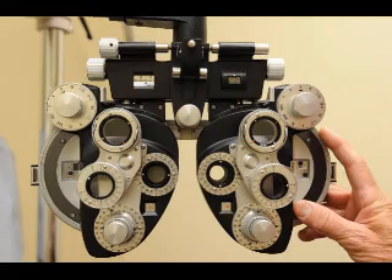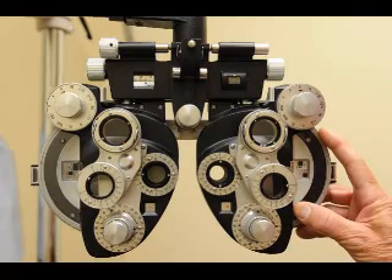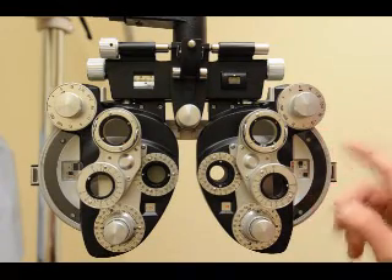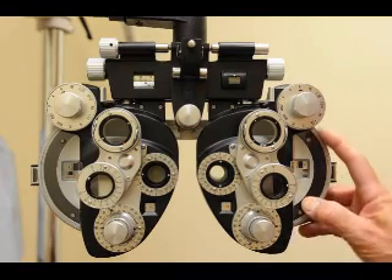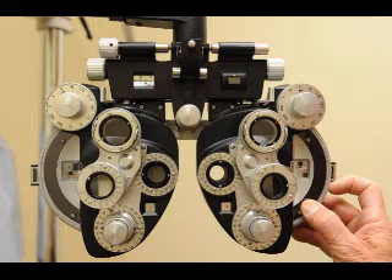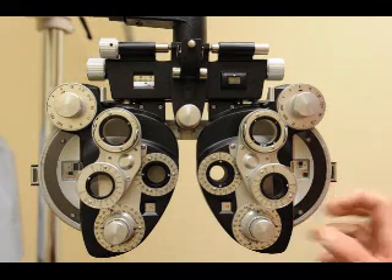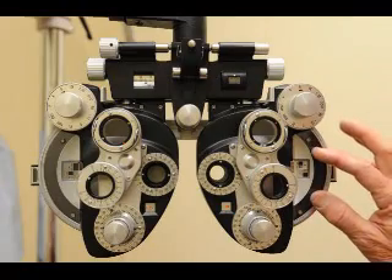Say 'Read that line as best you can.' They read it. 'Is it easier number one or number two?' They say two — good. 'Easier number three or number four?' They say four — still plano. So you're finished with the sphere.